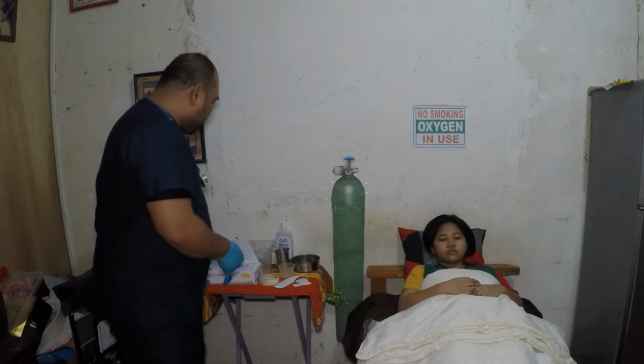So these are the procedures. We have to check the doctor's prescription, including the date, time, flow liter, minutes, and method. This is to avoid medical errors. We have to check the client's record first. Then we have to perform hand hygiene and wear gloves to prevent the spread of infection. And we have to explain the purpose and procedure to the patient to foster the client's cooperation and allay his anxiety.